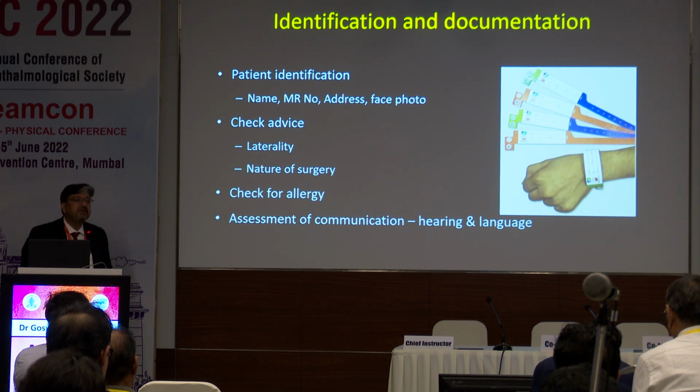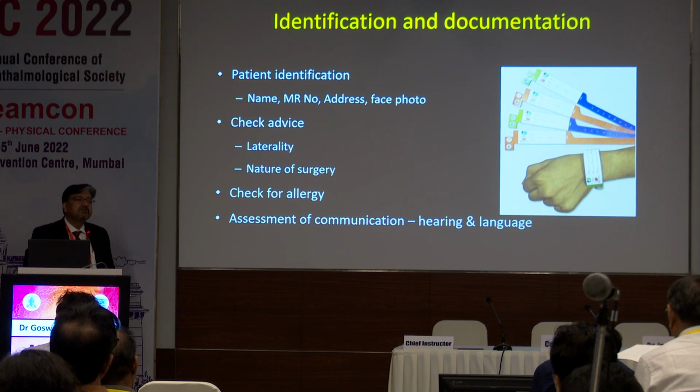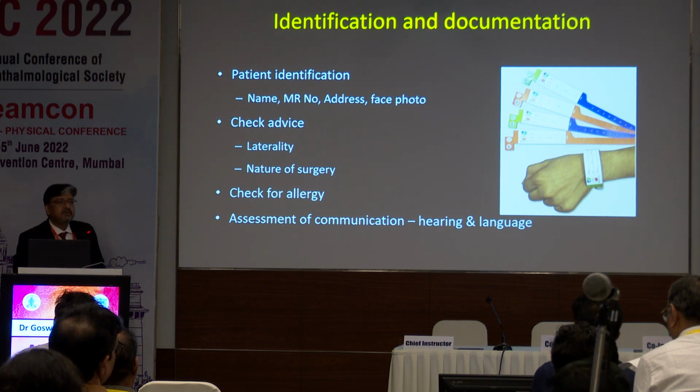Is he hearing properly? Is he a very old man? Is he somebody who's frail, who's not able to understand? Or he's from another region and is not able to understand your language? Because most of us now are switching over to topical phaco, and even with giving an injection phaco, local anesthesia phaco, we need to talk to the patient many a times during the surgery.